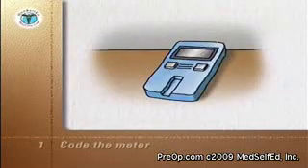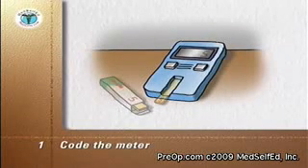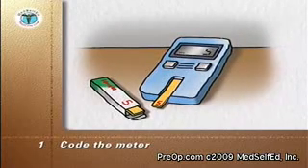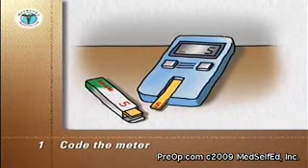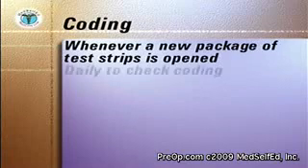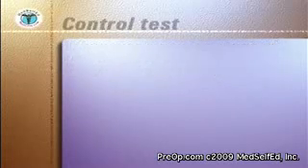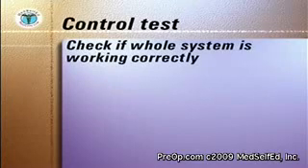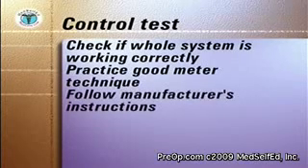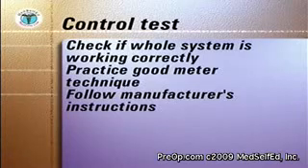The first step is to code the meter to match or calibrate the meter to the reactivity of the test strip. This is done by following the manufacturer's instructions and matching a number on the meter's display to a number on the code strip or on the test strip package. Coding is done whenever a new package of test strips is opened, and daily to ensure the meter is coded correctly. In addition, a control test can be run if you need to check that the whole system of the meter and the test strip is working correctly and to practice your good meter techniques. Follow the manufacturer's instructions, which usually involves testing a control solution of sugar that is provided with the meter.